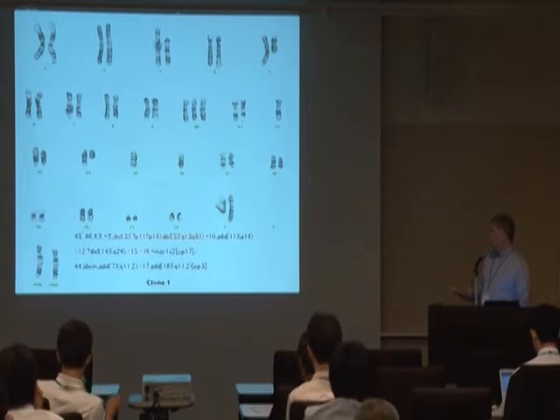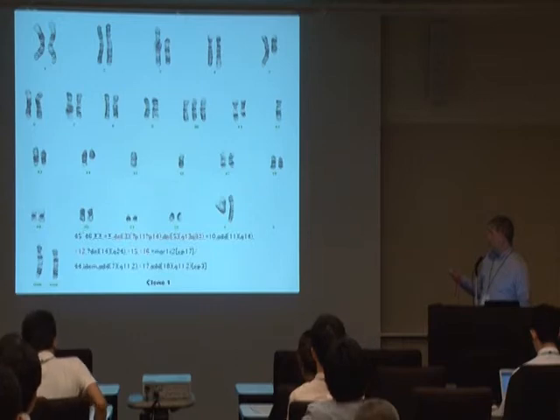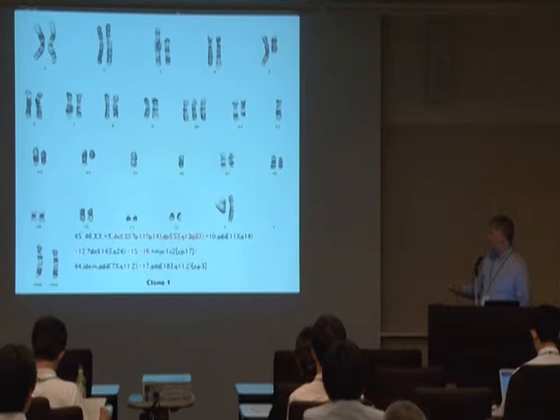And in a similar case here, also somewhat complex with many of the same abnormalities, we saw a small deletion of chromosome 3, deletion 5q, let's see, we had a plus 10 in this particular cell. We had a funny bottom of chromosome 11 here, which we called an add(11)(q14), minus 12, del(14)(q24), minus 15, minus 16, and then a couple of marker chromosomes down here in this composite karyotype.